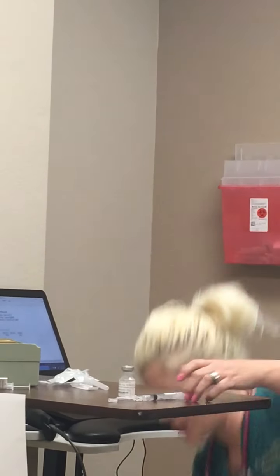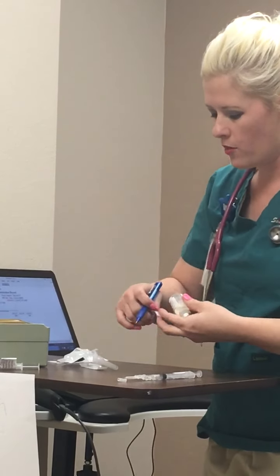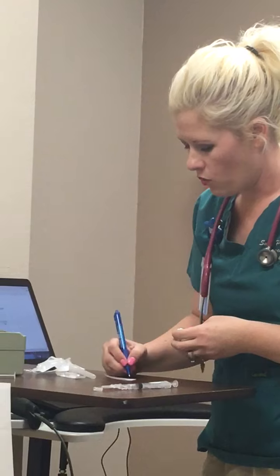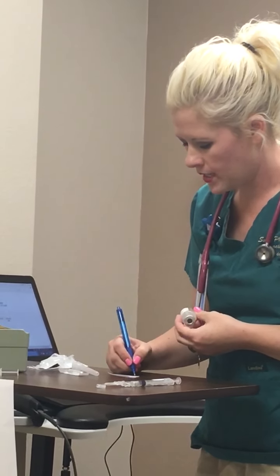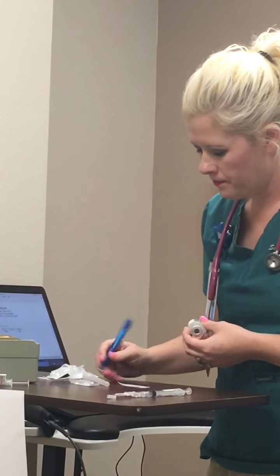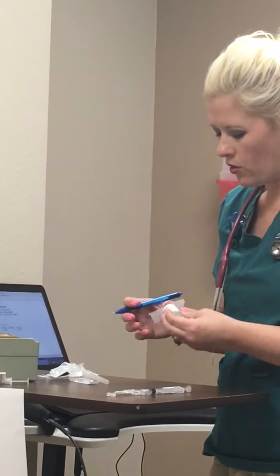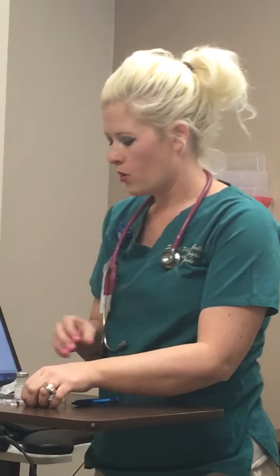I can put this down because I know what it is. Now I will go ahead and label the bottom of my vial so that they know when it was opened and the time. So my name, date, time. I'm going to go ahead and attach it to the bottom. Now I have both of my medications prepared.